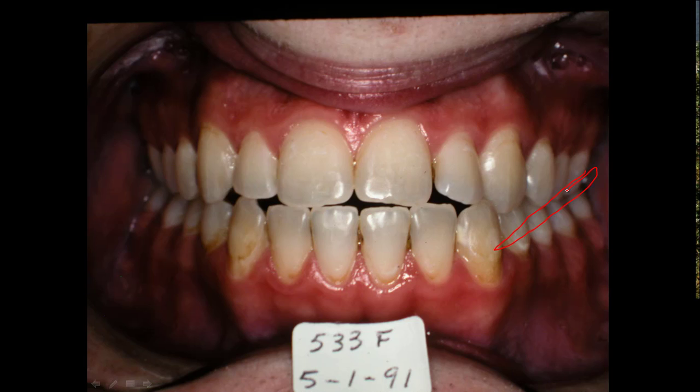And then you wear this elastics, put your button on your cuspid, but have the 4 to 4. It has to be out of a solid bar now. And the upper has to be in a good solid retainer all the way. And it'll keep it lined up, and it'll hold this back while he tries to grow. Now, as he grows and his jaw wants to come forward, it'll move the maxilla forward. Now, that's darn hard to do. But if the guy understands it, and you sit down and talk to him, he will tend to do that if he's really concerned about his teeth.